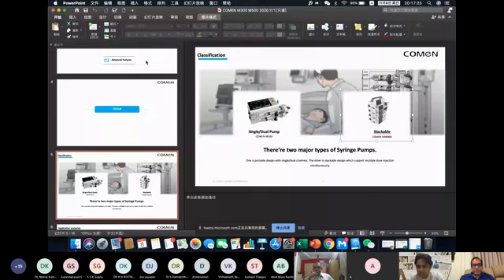Dr. Suresh, you have raised your hand. Yeah, I'd just like to highlight one more thing about the stackable. In ICU, NICU, any critical care setup, there's always a shortage of plug points and too many wires running around. So a major advantage of a stackable system is power management also. Just one power socket can supply however many syringe and infusion pumps. So for a practical purpose, in terms of wire and cable management, it also has a lot of value.